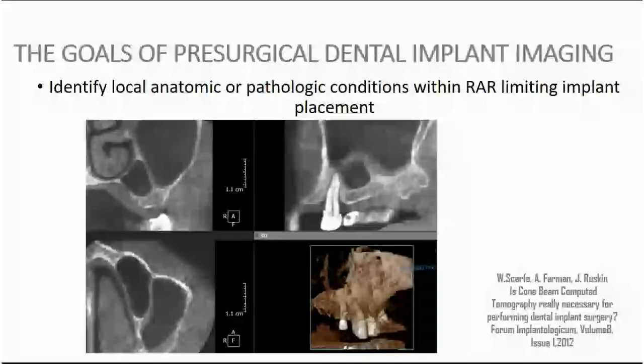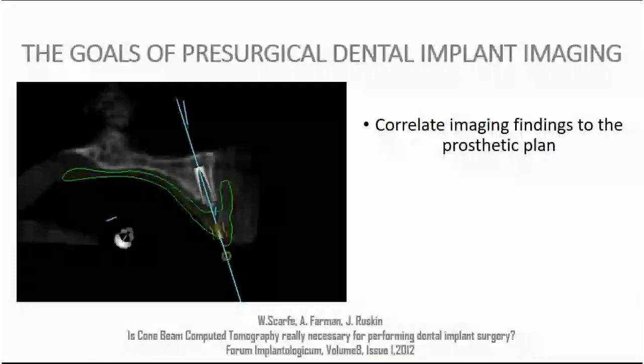But we have the opportunity to differentiate these kinds of specific situations and to manage them in the best possible manner.